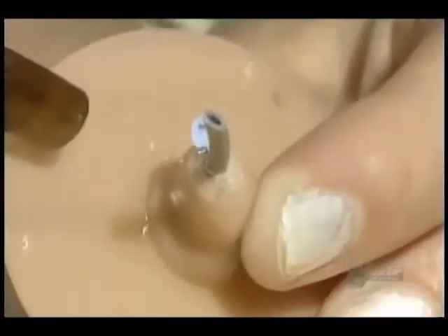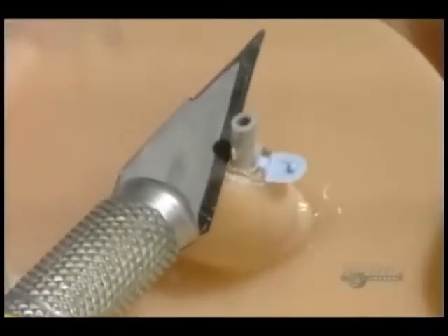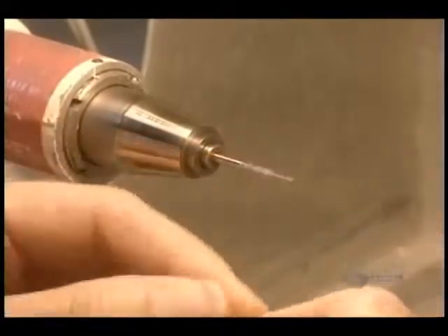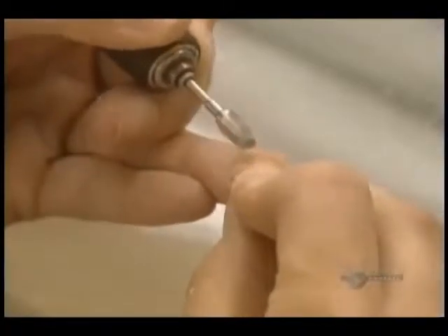The two parts of the hearing aid are then glued together and ultraviolet light hardens the glue. The plate used to position the prosthesis components is cut away with a drill, then the hearing aid is manually polished to make it perfectly smooth and comfortable.